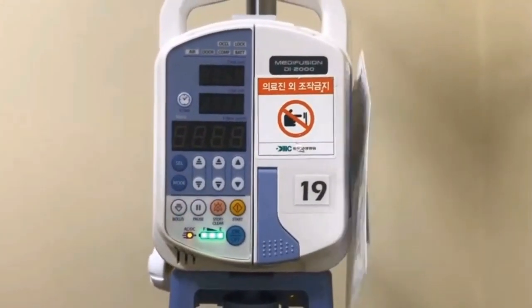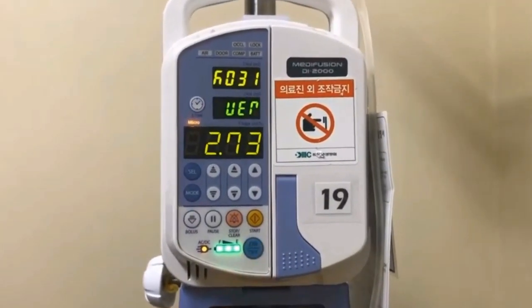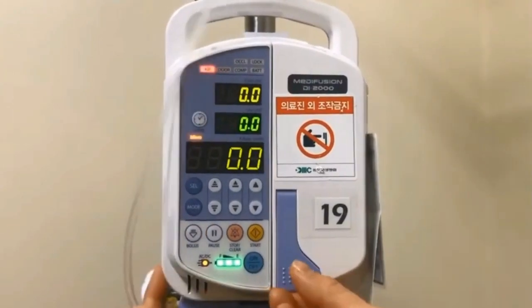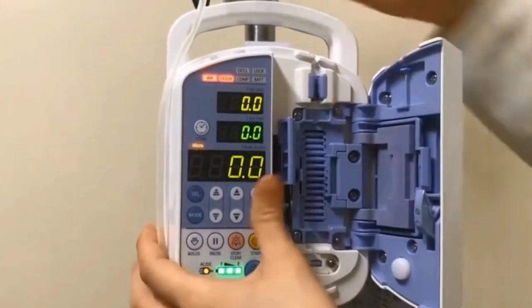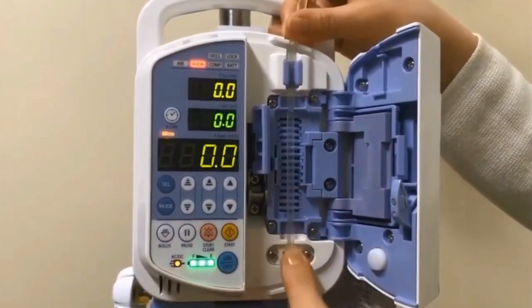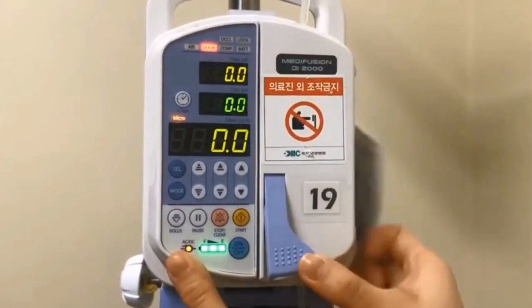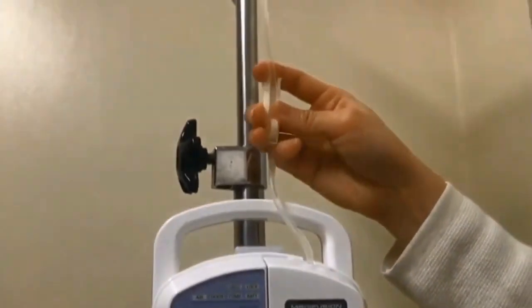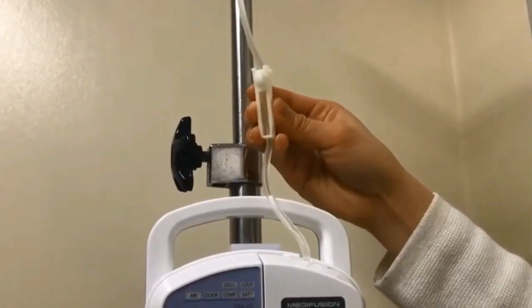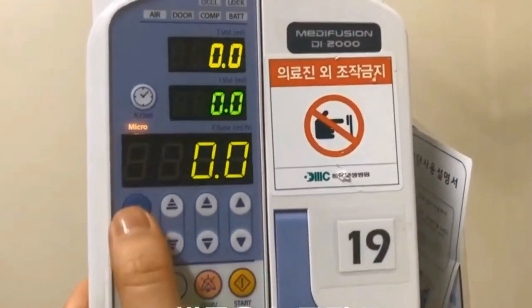To use an infusion pump, one must perform a thorough examination of the patient and keep track of their vital signs. The drug or IV fluid to be infused will be drawn up by hospital professionals who will also check that the infusion pump is working properly. The infusion tubing is appropriately linked to the patient's intravenous line. It's necessary to monitor the pace of infusion pump delivery.